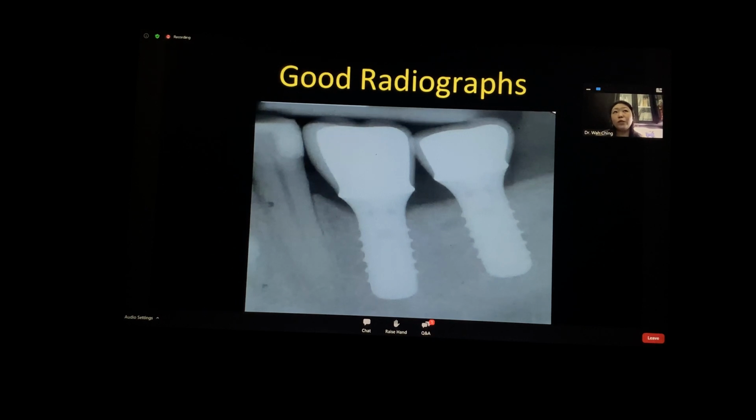When we do the normal clean, if the patient has mucositis or just plaque around the implant, what we usually do is use a non-metal curette. They have special hand instruments for implant cleaning. They can be graphite ones, carbon ones, or I tend to use the titanium ones. You can also use rubber cups.